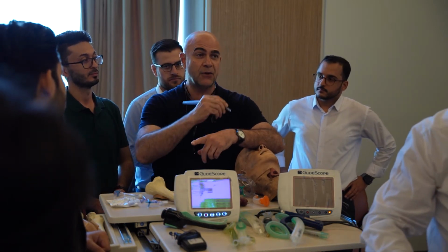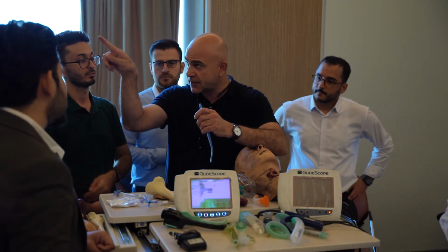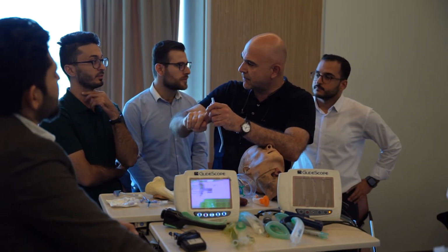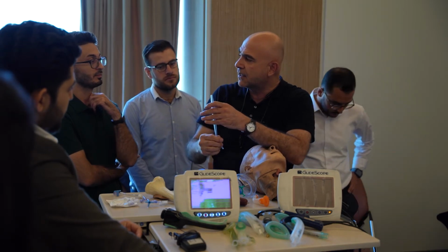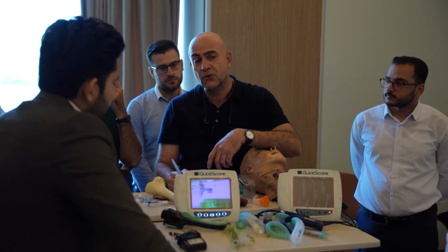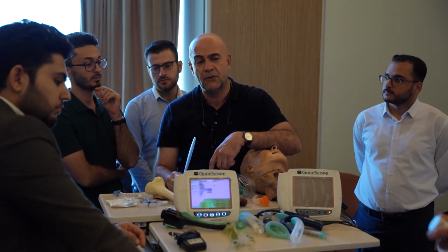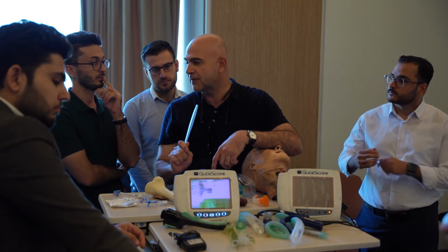If the patient has an LMA and there is end-tidal CO2 on the LMA, and you see on the graph a sudden upstroke or rise of the CO2, it means your patient has return of spontaneous circulation, and after that you are going to intubate.